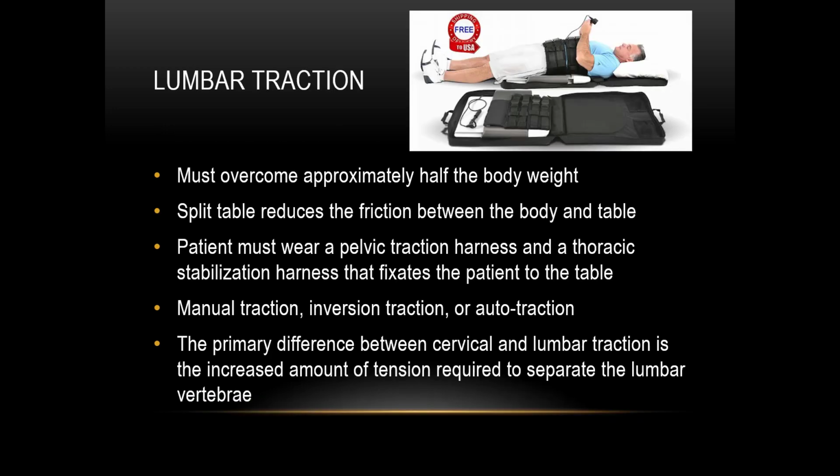With lumbar traction, it takes a lot more force than does cervical spine traction. We must overcome approximately half of the body weight in order for lumbar traction to be effective. A split table can reduce the amount of friction between the body and the table and can be a lot more comfortable for the patient during the treatment.